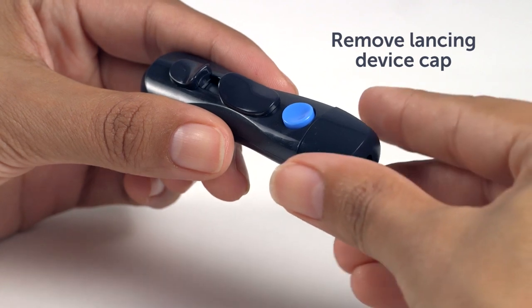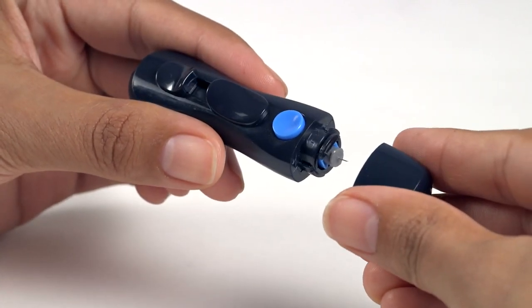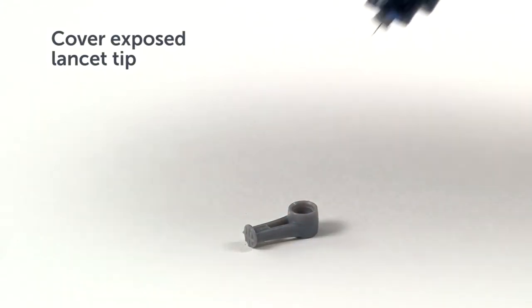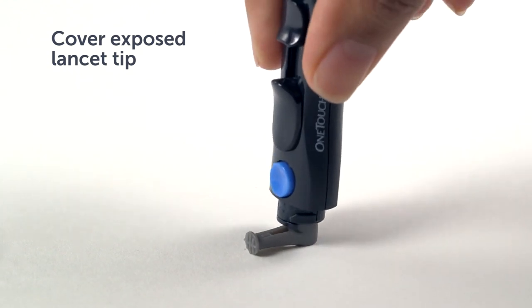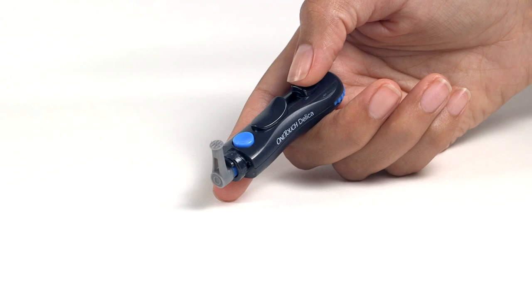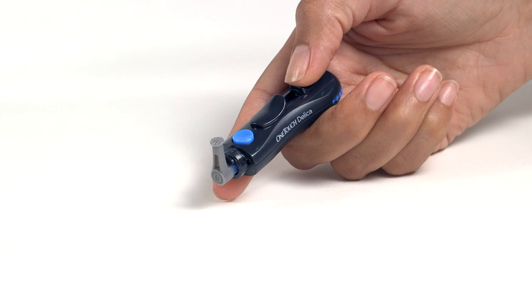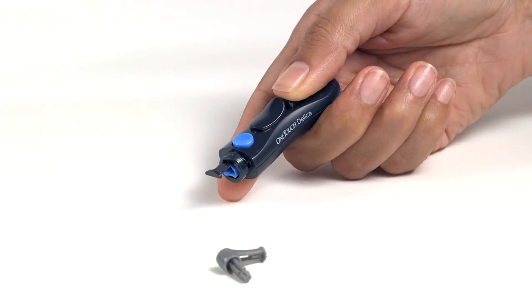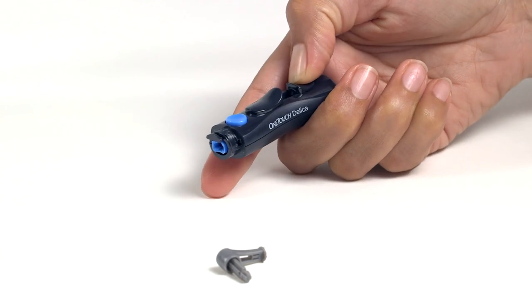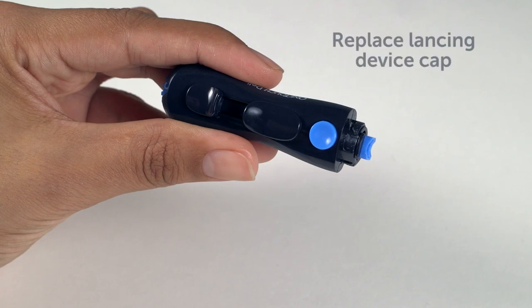Remove the cap by gently turning it counter-clockwise, then pull it straight off the device, just like before. Remember your protective lancet cover? Before removing the lancet, place the lancet protective cover on a hard surface, then push the lancet tip into the cupped side of the cover. Eject the lancet by sliding the ejection control forward until the lancet comes out of the device. Return the ejection control to its back position. If the lancet fails to eject properly, cock the device again and then slide the ejection control forward until the lancet comes out.